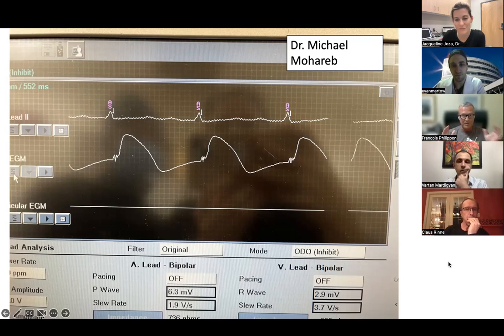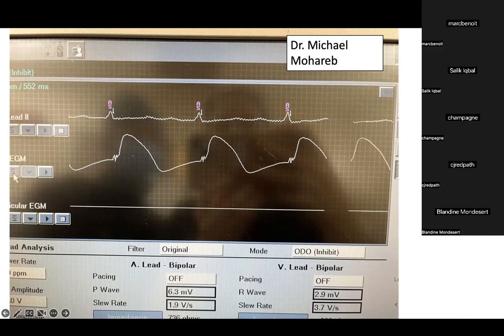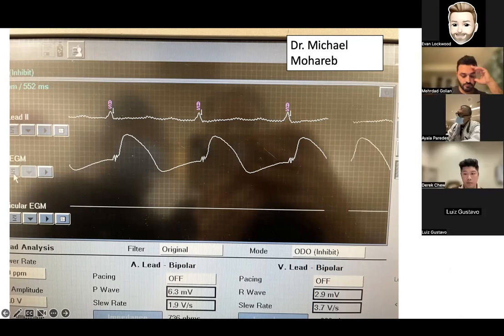If I think I'm probably okay, then I will look at the fulcrum and do a little contrast to make sure I'm deep enough in the septum. But certainly we perforate more often searching for the best QRS. It's not a big deal.